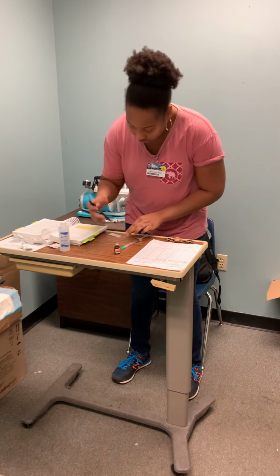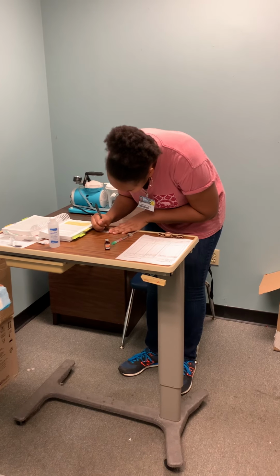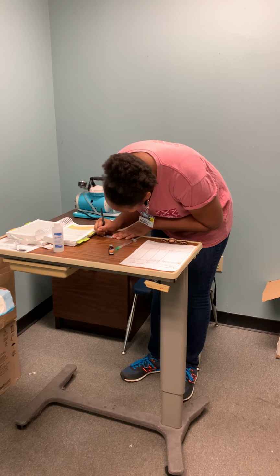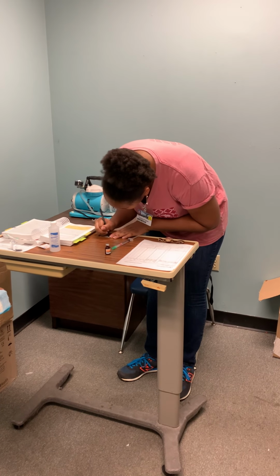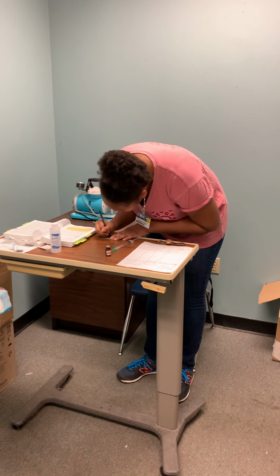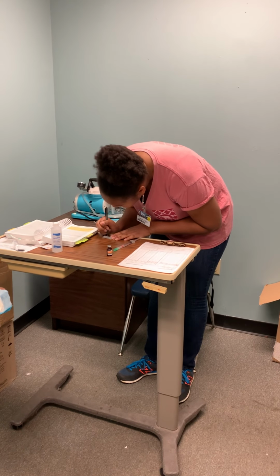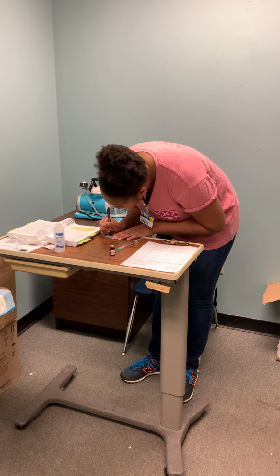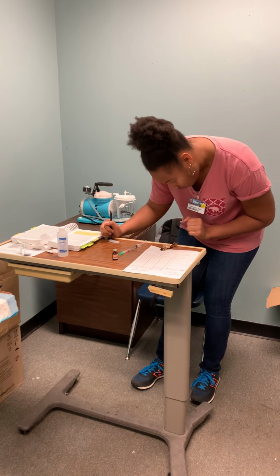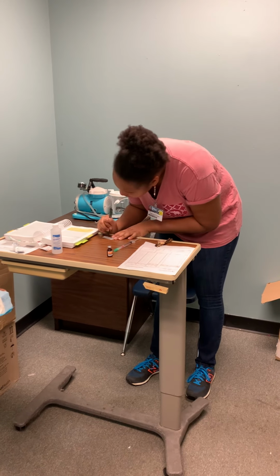Next, I label my patient's medication with her name, Janet Green. She'll be receiving furosemide, 30 milligrams. Today's date is January 29th, 2020. The time is now 13:44. The expiration date is 7/20/21.